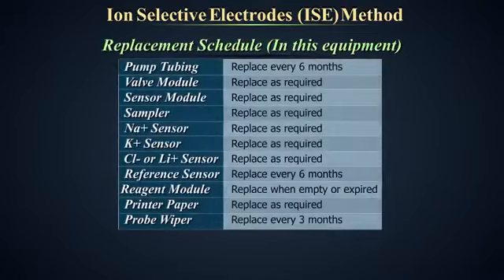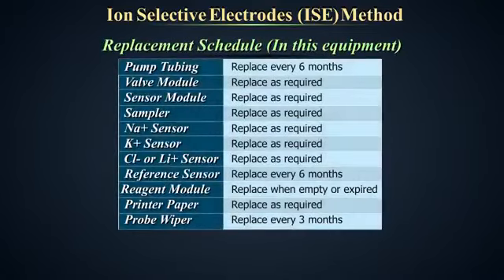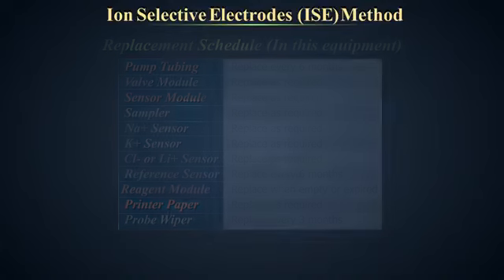Replacement schedule. The following schedule should be followed. Out of these, pump tubing, sensors, reagent, and printer paper can be done by the technician. The rest should only be performed by the service person or engineer.